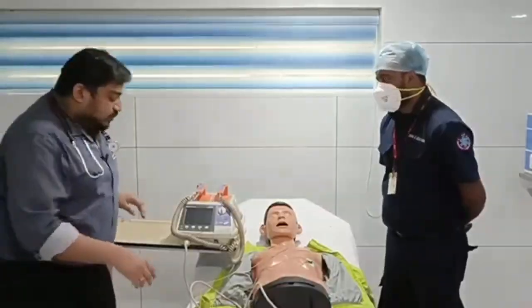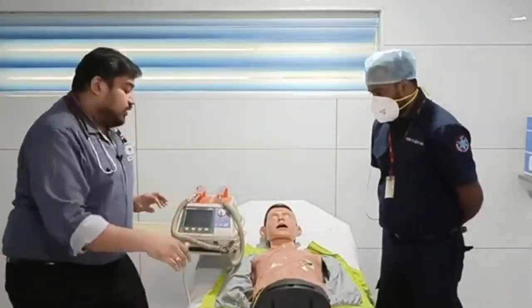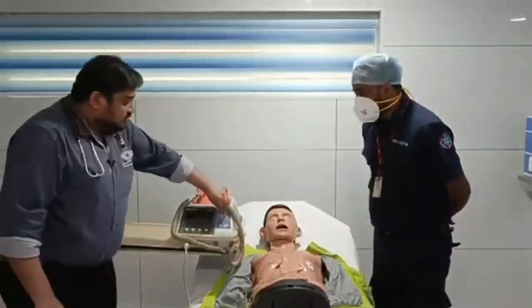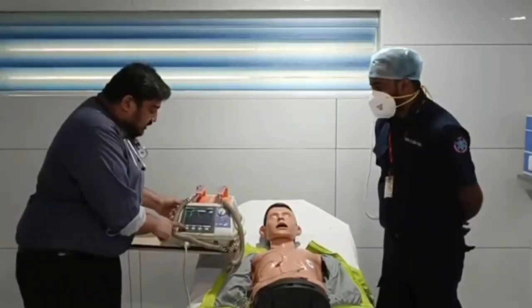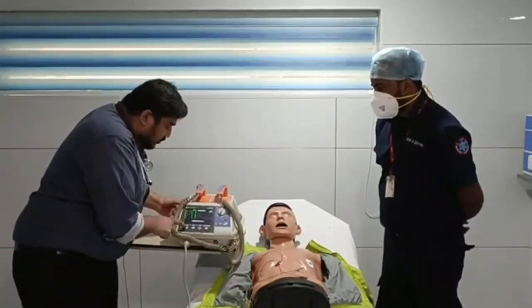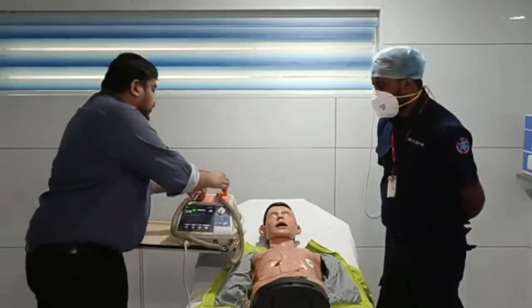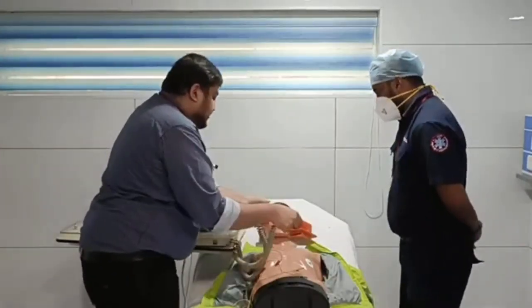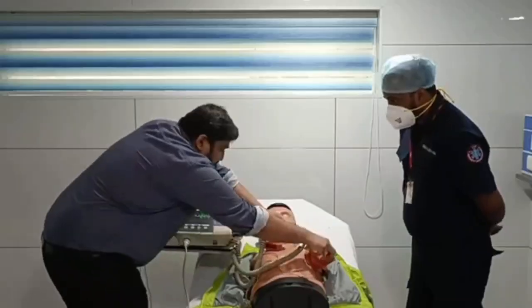And sometimes if you are missing this cable, you are not able to find it, somebody has misplaced it, then what you can do is switch on the defibrillator. As I have shown, there is a lead button here, and you can press the lead button. The lead button shows aux, and then it shows paddle. Once it comes to paddle, you can just take out the paddles and keep them over the patient's chest, one over the sternum and one over the apex. That itself will give you a rhythm.